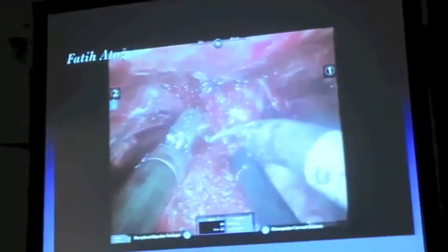So think of 3 different exposures, 3 different dissection planes, and that's how you, back to his question of how do you maximize the urethral length, you have to attack it from 3 angles and sweep it back to get to this point where you can see on the right side the nerve bundle's off and out of the way, and you have to get to that point to do it. So this really is the Pandora's box of so many different things within a short amount of time.